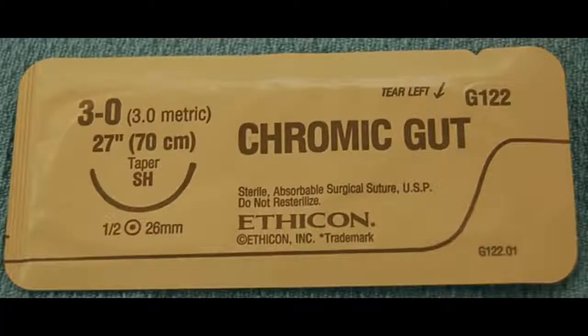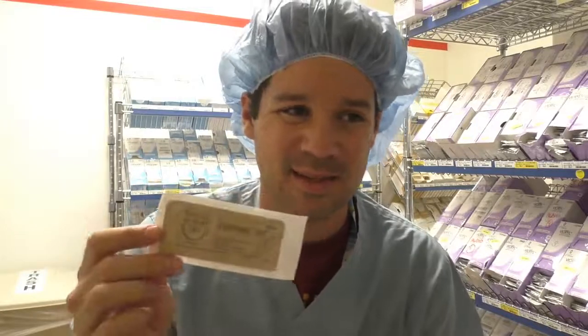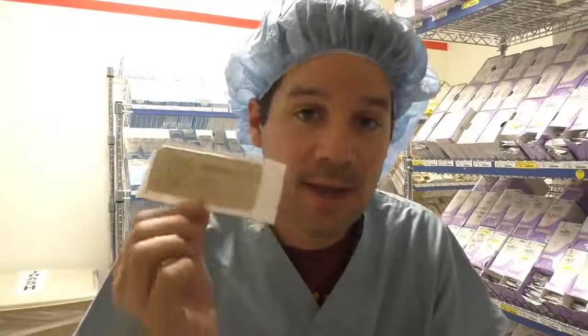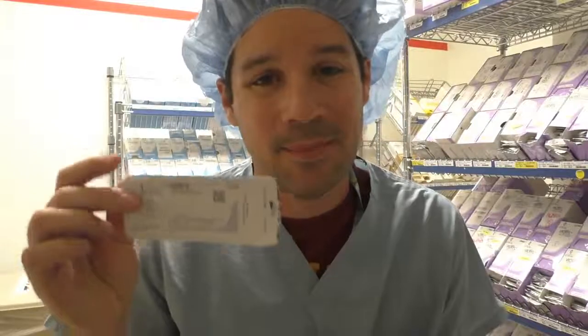Third stitch I have for you is the chromic. This chromic is interesting. It's got this brown packaging. You can't see what's inside. When you open up this package, it has a very pungent smell. It sits in this alcohol type solution, and it says chromic gut because it's actually made from the intestines of an animal, and it's just got a very interesting smell. This is highly absorbable, which is fantastic, and where I've seen this used mostly is circumcisions actually, and peds, stuff like that. Chromic.